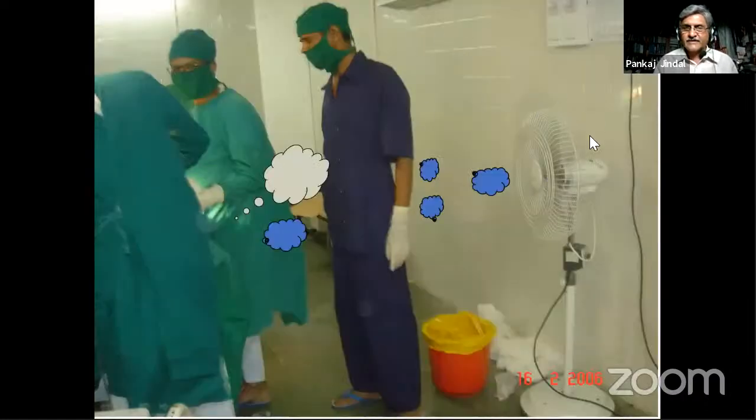And you see this is an absolutely no. This is an internal fixation going on here. And this gentleman goes everywhere into the city with this dress here, and all the dust is coming from the fan onto the field here. And this is again an absolutely no, to avoid any contamination and infection here.